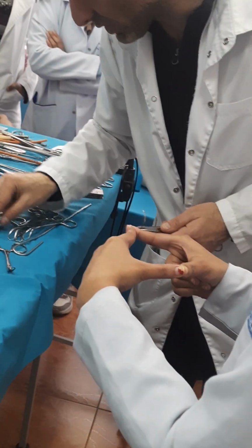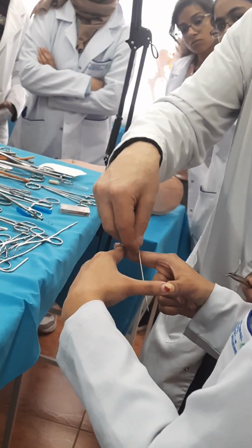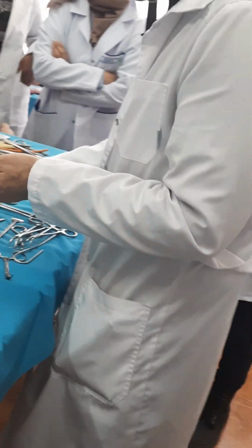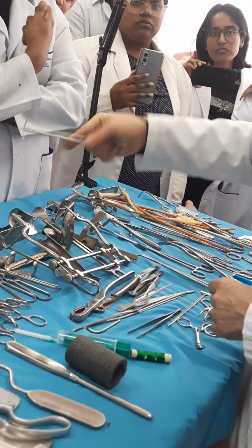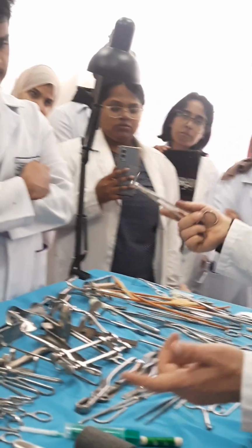For example, this is my straight needle. I must insert my hand together with it, and I will damage everything. For deep structures, simply, with a curved needle you can catch deeper structures by round movement and make the suture.